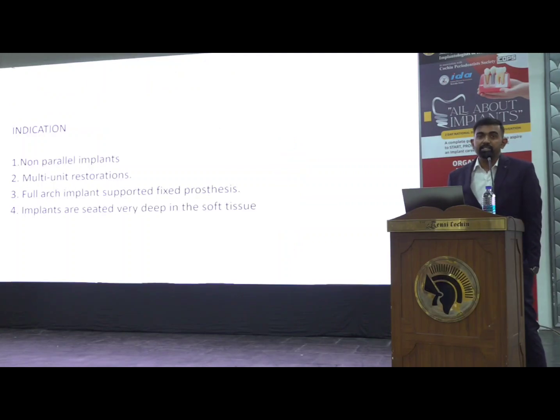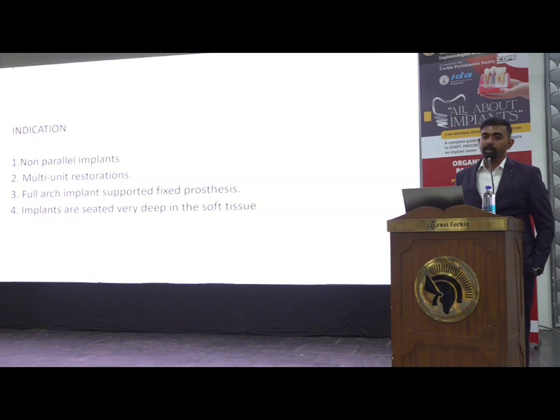And indications, in which cases you can use open tray impression techniques: if your implants are non-parallel, full arch prosthetic cases, implants seated very deep into soft tissue, and multi-unit restorations. And open tray impressions are considered the gold standard of implant impressions.